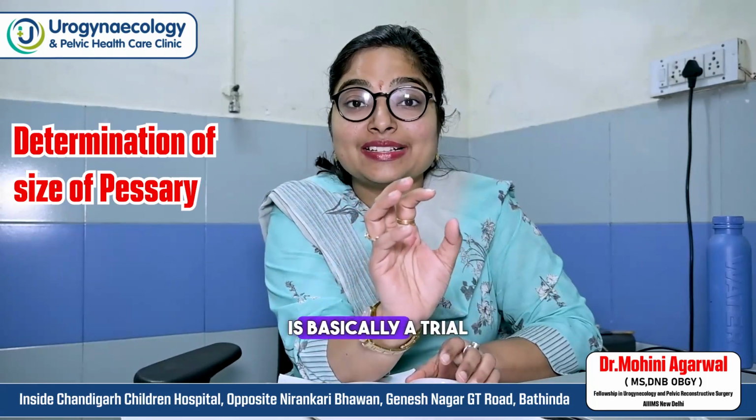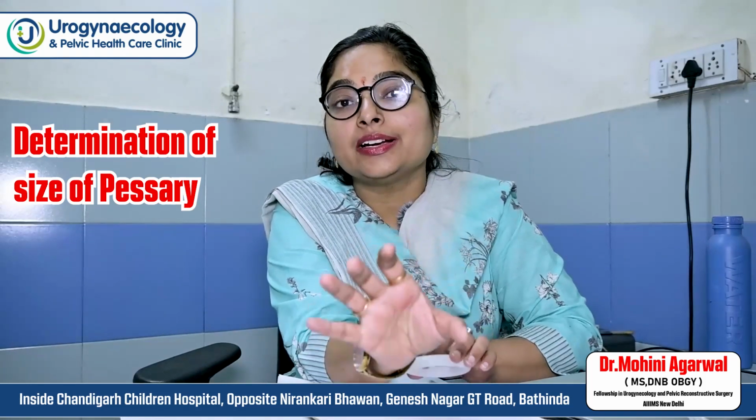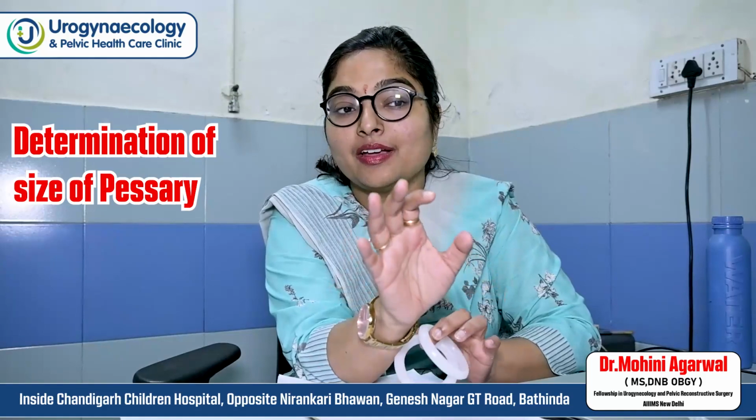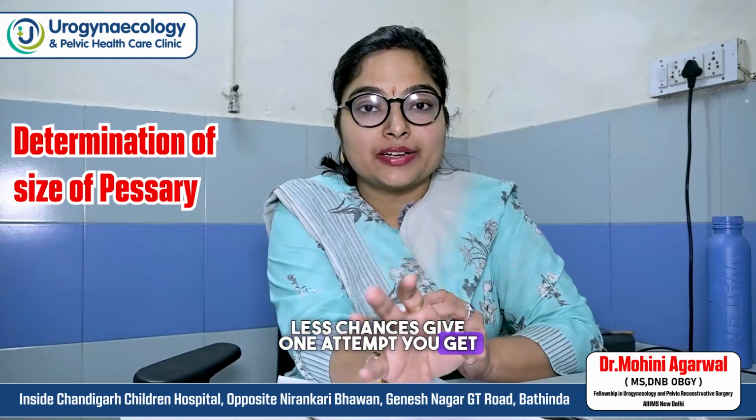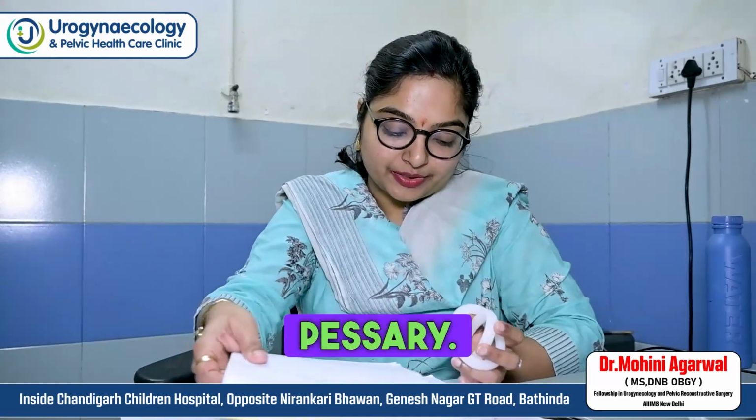So pessary fitting is basically a trial and error method, and it usually requires 2 to 3 attempts to get the correct size of the pessary. Fewer chances give you one attempt and you get it right. Okay, so this is the pessary, and this is how you choose the size of the pessary.